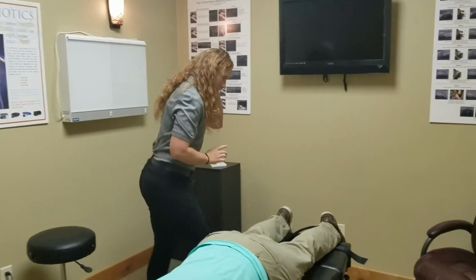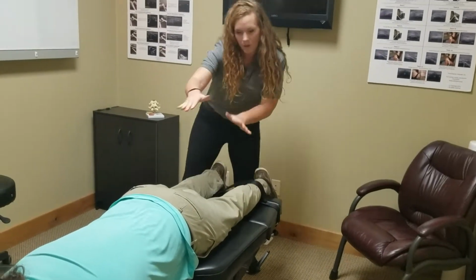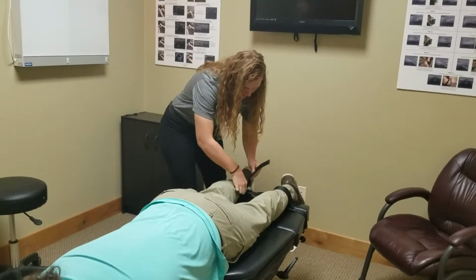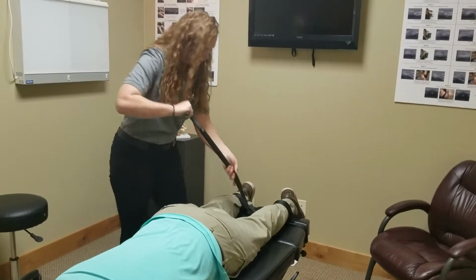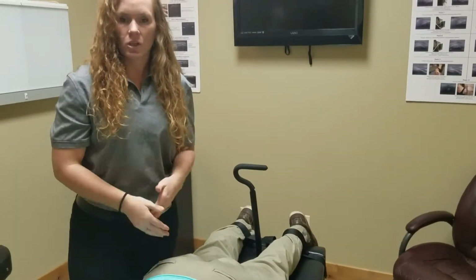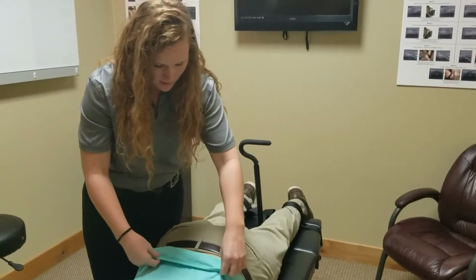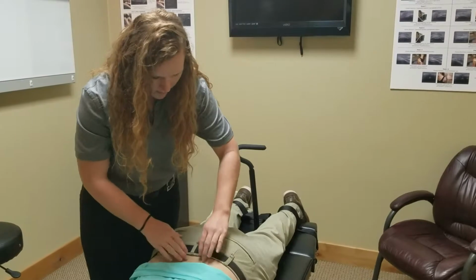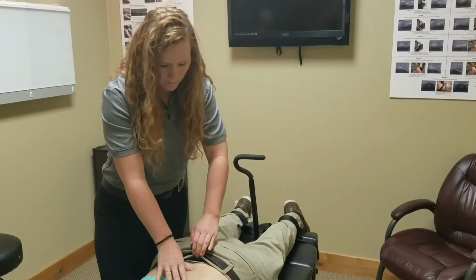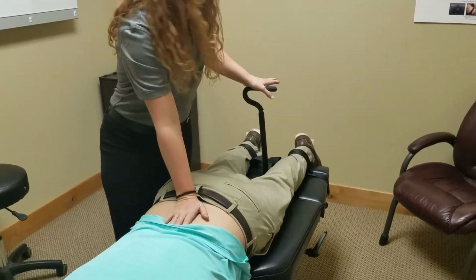So what I'm going to do with this technique is strap our patient's legs in so we can open up and create space in there. And then we have this little handle that we put on our table. Instead of doing a side posture adjustment or the table going up and down with a drop piece, I'm actually going to lift your shirt, if that's okay, David, a little bit. I'm going to put my hand right on his low back, right where that L5, L4 space is, and put some pressure in there to help open up while I open up this table.